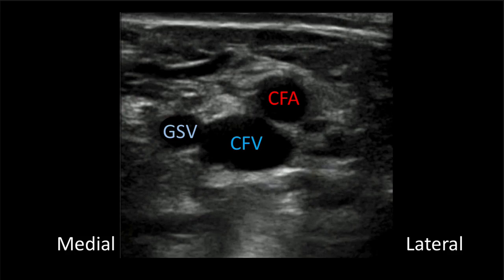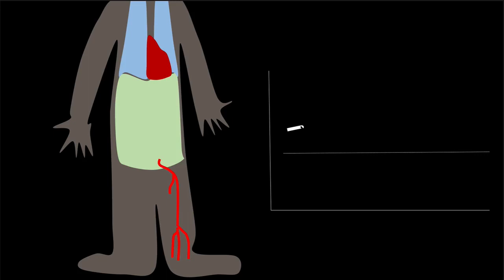So next point, this is a little bit of physiology, but it's also normal venous ultrasound theory, Doppler theory. There's this thing, respiratory variation. It's normal. It happens because of changes in intra-abdominal pressure produced by motion of the diaphragm.